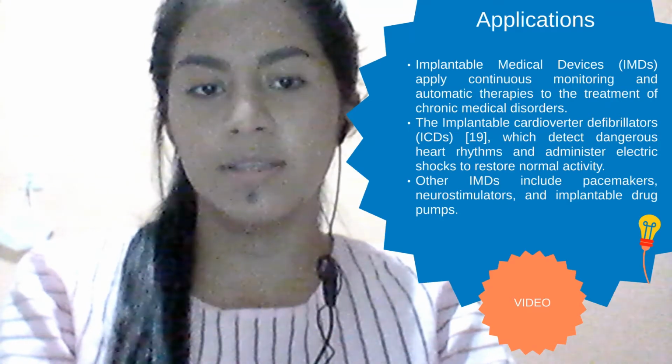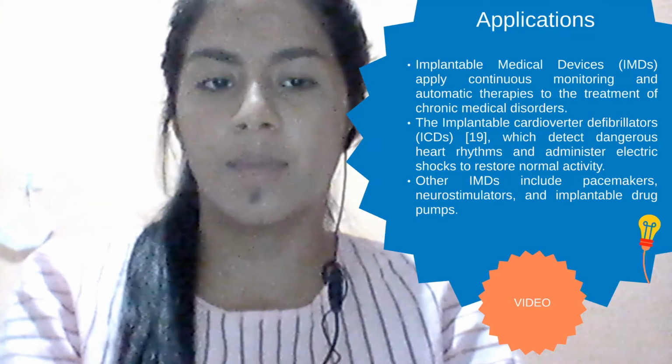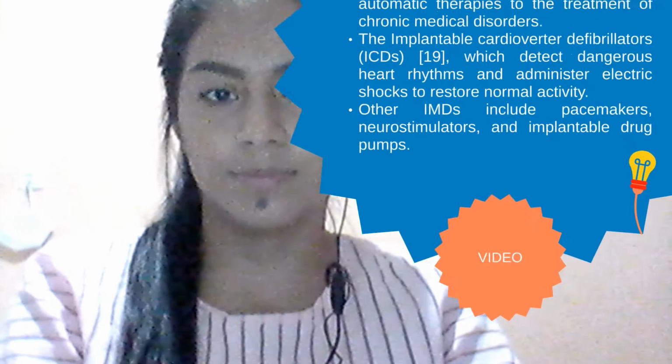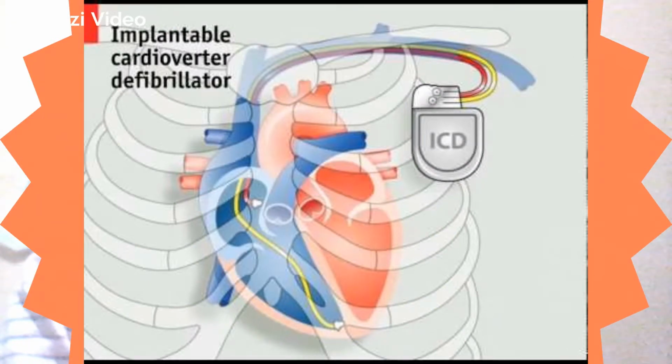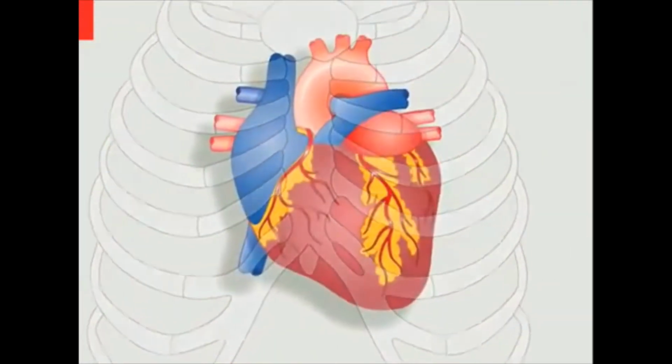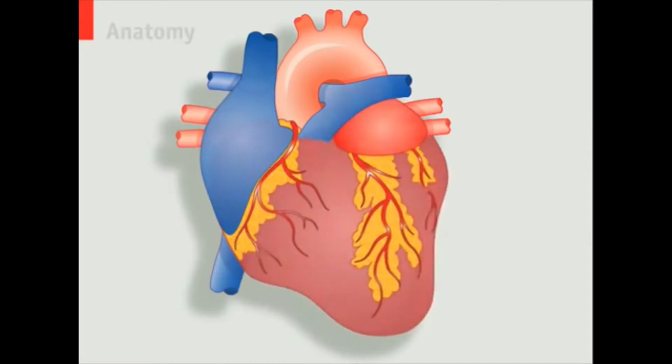Other IMDs include pacemakers, neurostimulators, and implantable drug pumps. As the technology improves and the list of treatable conditions grows, the number of devices being implanted is increasing steadily and now exceeds 500,000 a year.